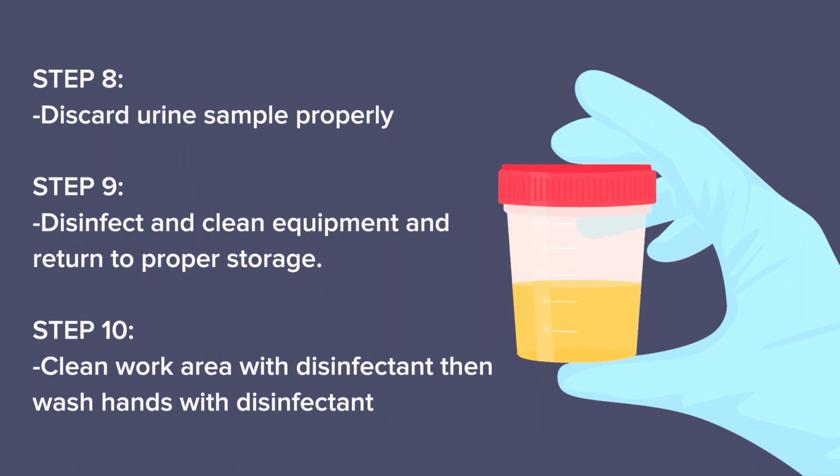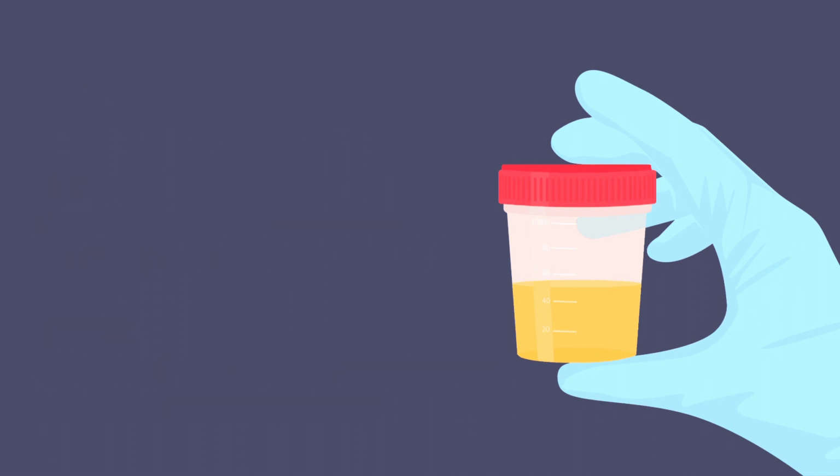Step 9. Disinfect and clean equipment and return to proper storage. Step 10. Clean work area with disinfectant, then wash hands with disinfectant.